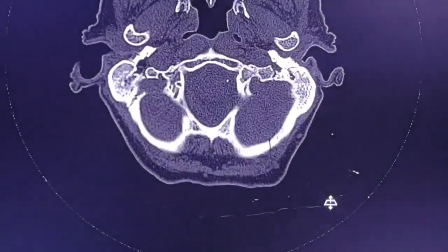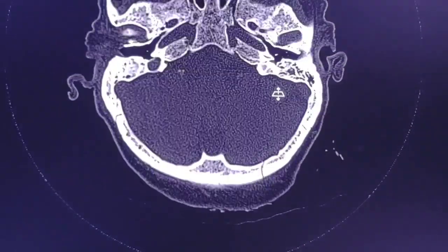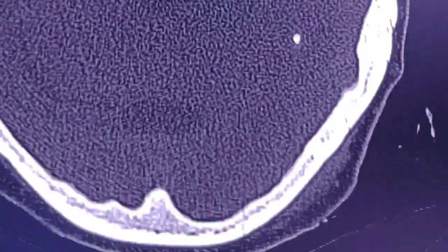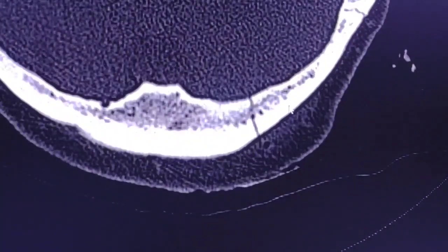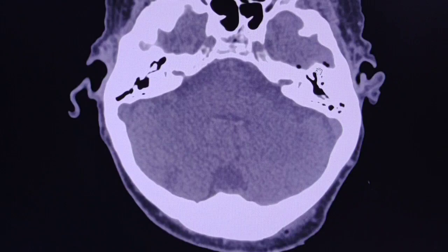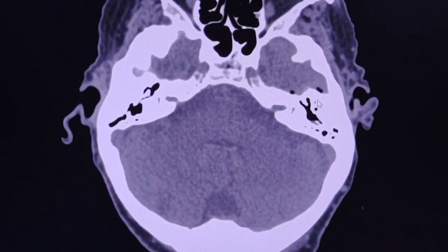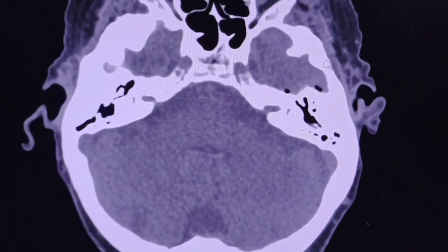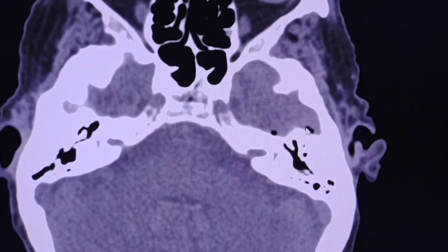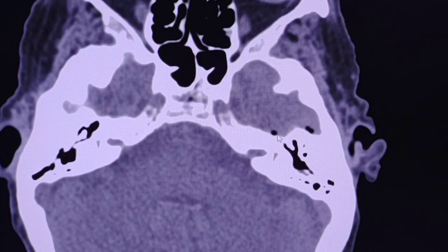Let's see the fracture again — here it is. Don't forget to use different window imaging settings so you can see all the findings. As you can see here, there are some gas bubbles on the left side of the middle cranial fossa, and this finding represents pneumocephalus.